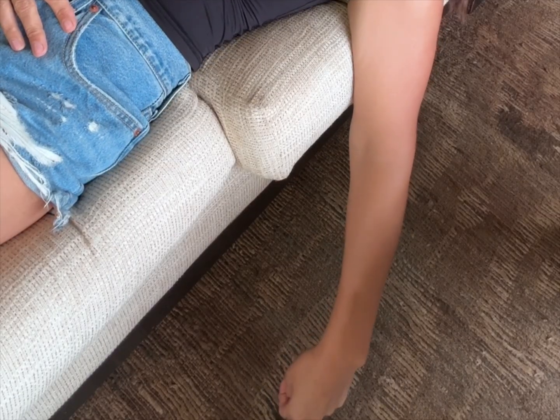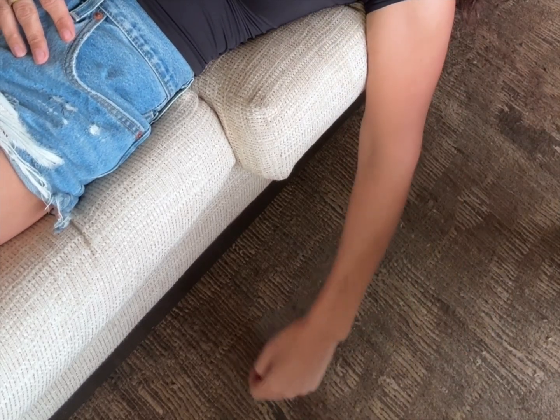I'm going to start an IV in my hand using gravity. Right now I have my feet elevated - higher than my heart - doing nice deep breaths, and where I want the blood to go I'm laying that closest to the ground. Give it about two minutes; this isn't a fast thing. When using gravity you have to allow time for blood to shift down the extremity toward the area closest to the floor.